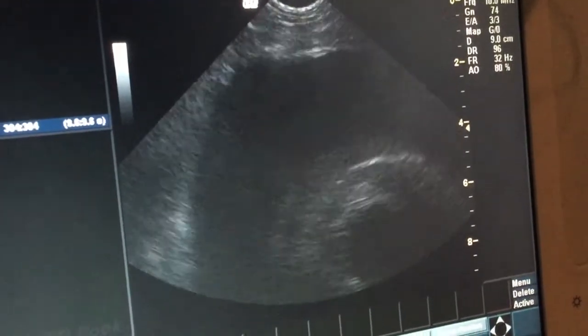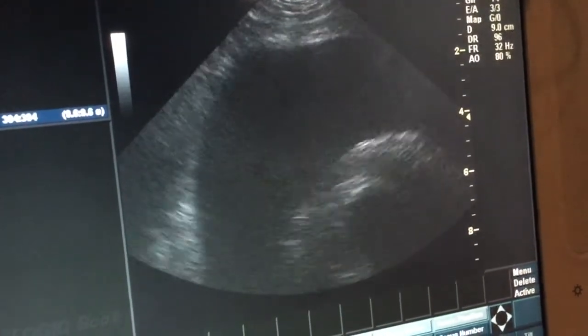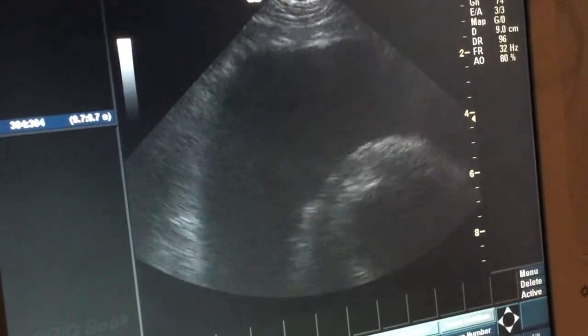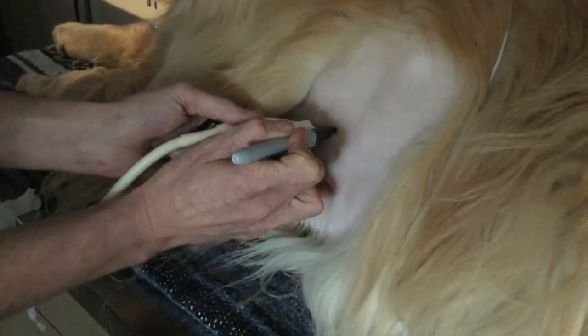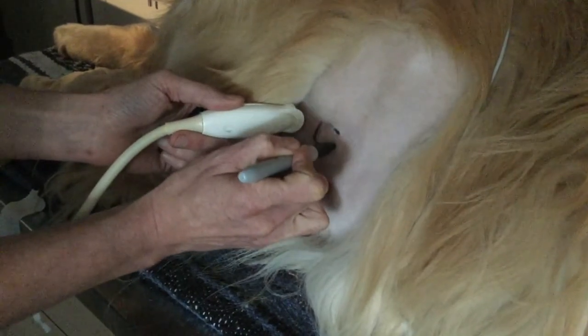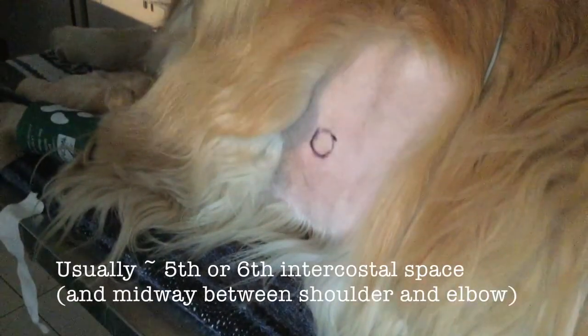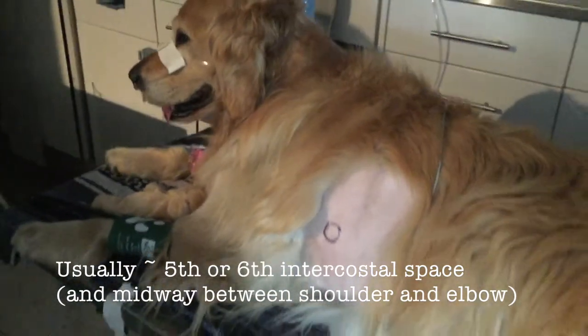Start by selecting your optimal centesis site using ultrasound. This may be on the left side or the right side depending upon the patient and whether or not they've been in prolonged lateral recumbency. This is usually at approximately the fifth or sixth intercostal space, midway between shoulder and elbow level.